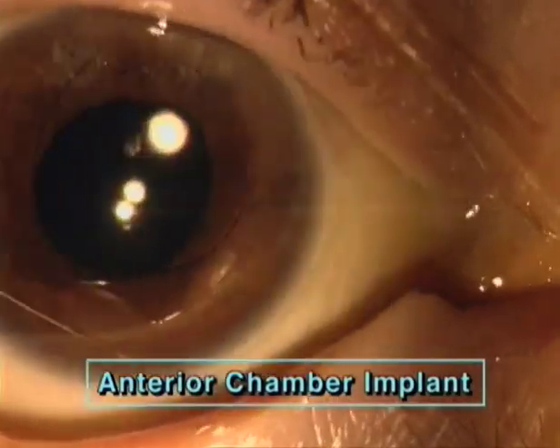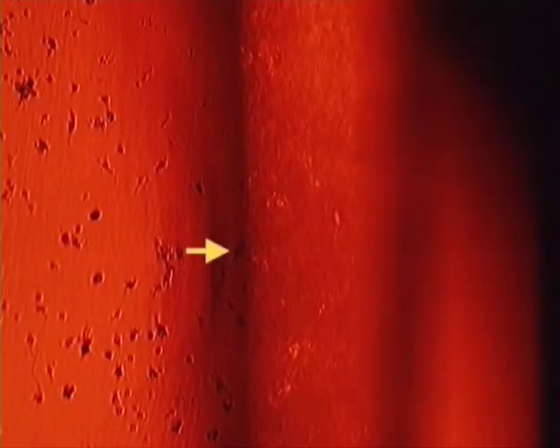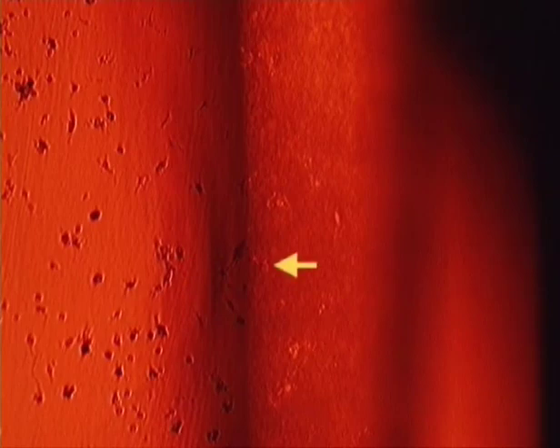Here we see an unstable anterior chamber implant. The endothelial cell pattern is interspersed with strongly reflecting speckles. Here seen side by side with retroillumination. These glistening speckles are related to the light-absorbing phenomena in retroillumination, as seen here at the margin of the illuminated field, in specular reflection. The glistening speckles seen in specular reflection are caused by pigment, which can be recognized here in retroillumination.